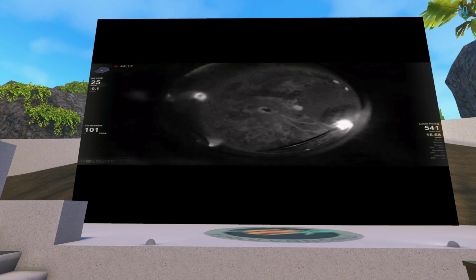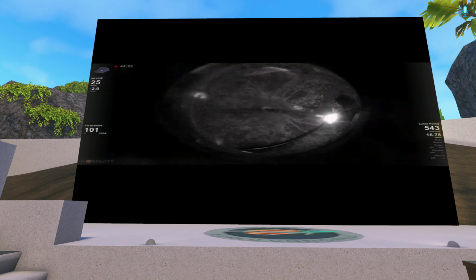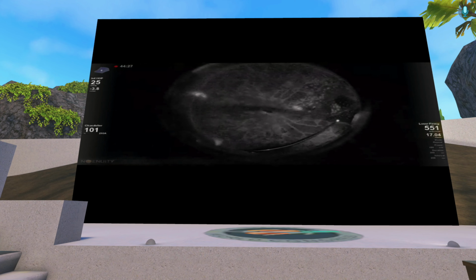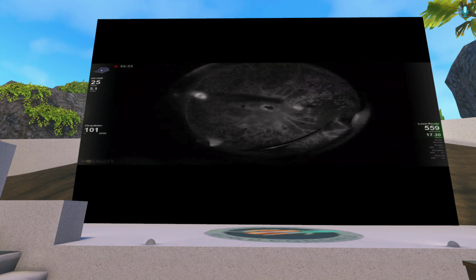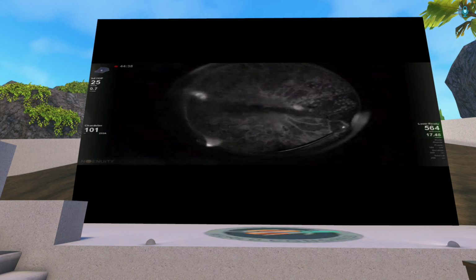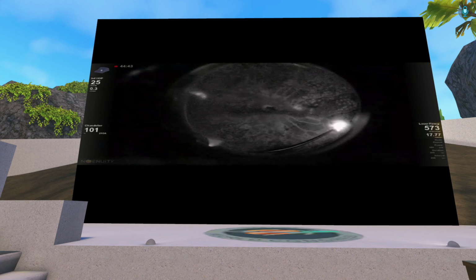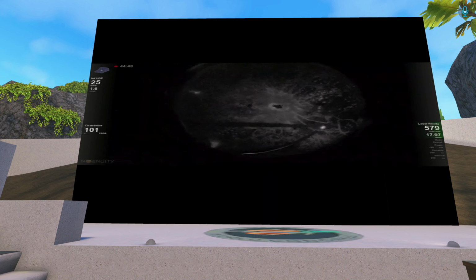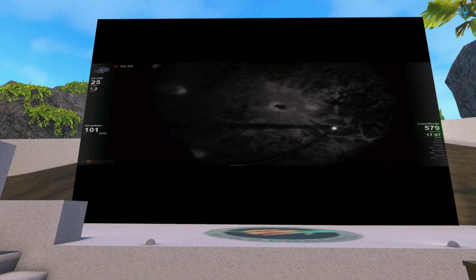So here, due to the specificity of the endolaser, I do believe that we cause less post-operative inflammation, which directly relates to the health of the eye itself and most probably to the macula, because in the diabetic eye, along with the ischemia, there are a lot of inflammatory processes going on, and on top of that, when we laser the retina, we induce again inflammation.